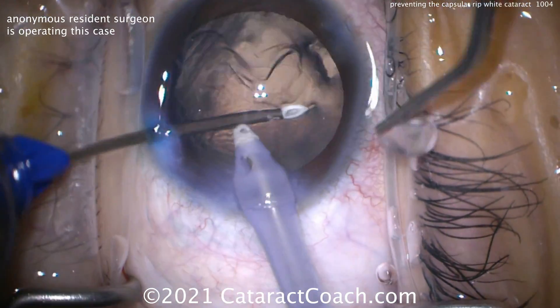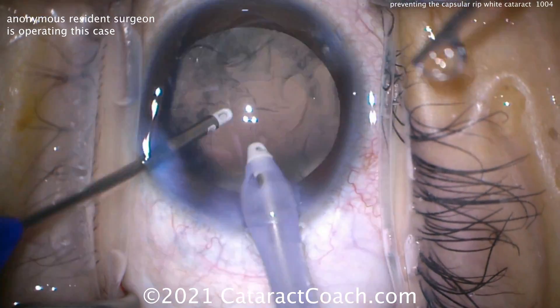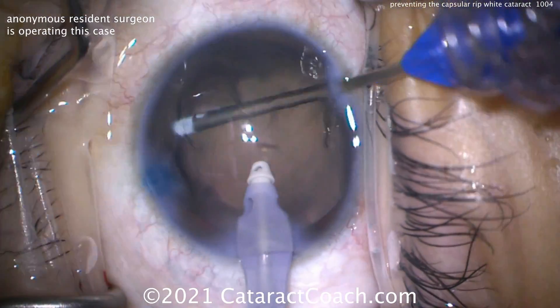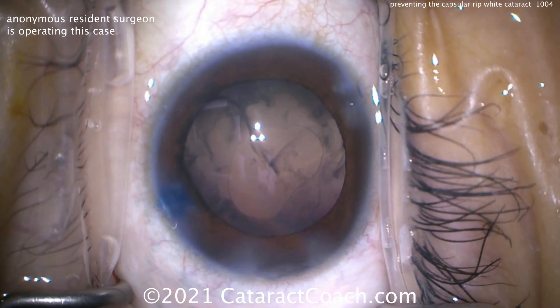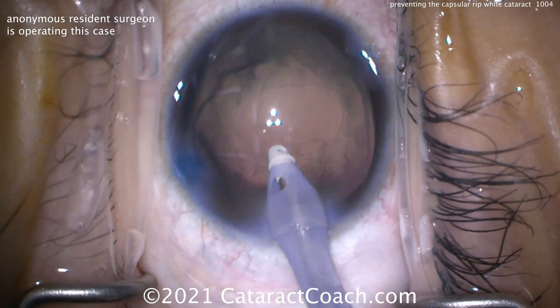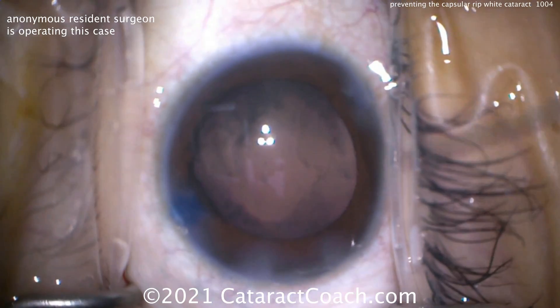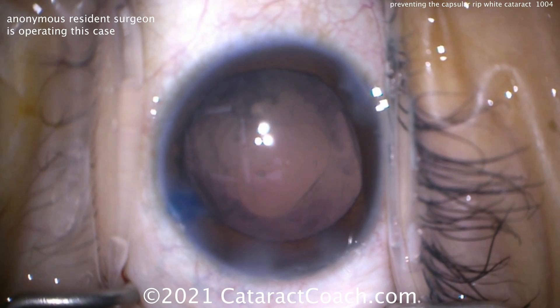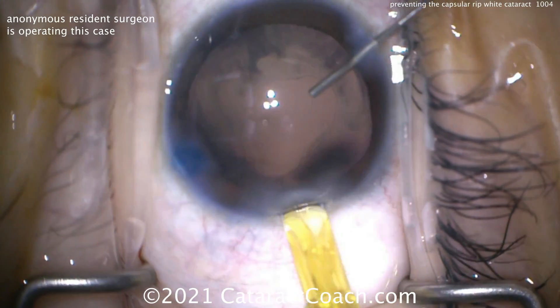That all looks pretty good. Once we get the IOL in the capsular bag, then we can enlarge the rhexis. Cleaning up as best as we can — a little bit of capsular polishing. You don't have to go crazy here, just do a beautiful job. Filling up the bag and trying to get out a little more lens material. The IOL will be a single-piece acrylic lens with a 6mm optic.